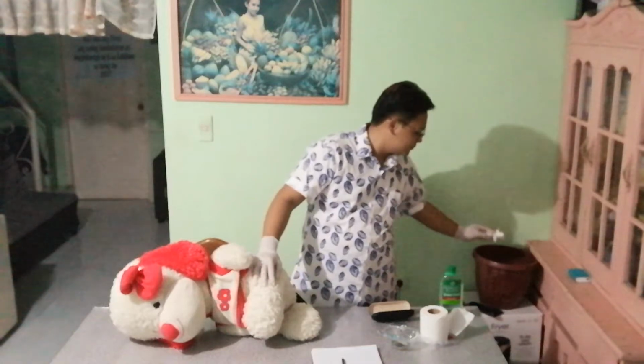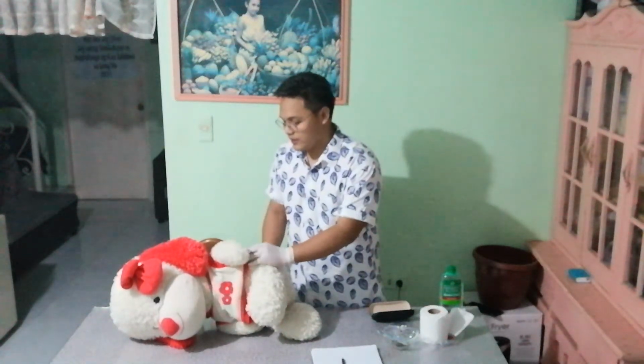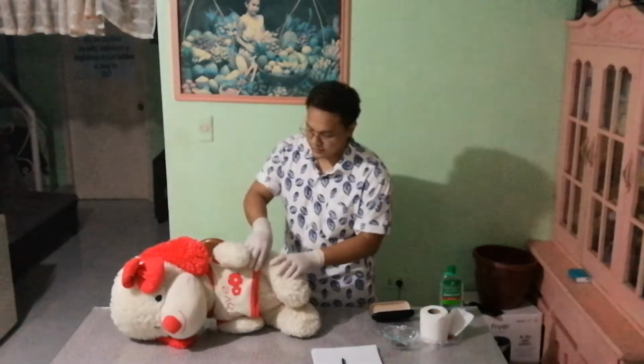Next thing you do is you need to dispose the tissue. So for our 10th step, we need to cover the patient and help the patient to a position of comfort. I will now, ma'am, return the position of your clothes.